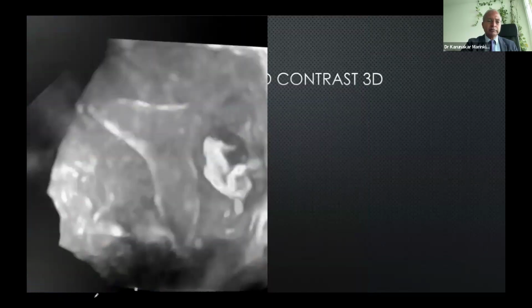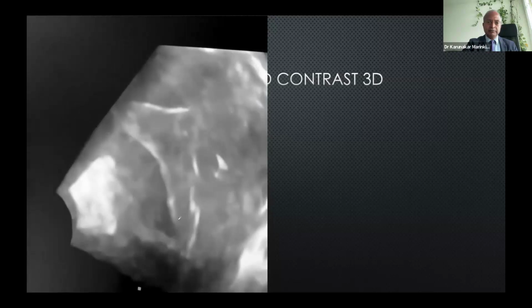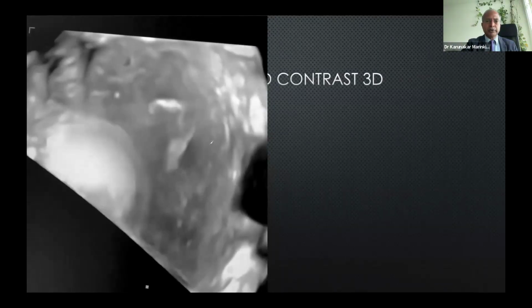Now, this is another case which was referred to me, asking whether they should do a myomectomy. I simply said to them after doing the 3D, leave alone that myoma, collect the eggs, because she also had hydrosalpinx. Preserve the oocytes, preserve the embryos before you play with any myometrial pathology or tubal pathology or adnexal pathology. You might be able to see there is the endometrial cavity. It's one of the oldest 3D machines I've ever used. I don't remember which year I took it.